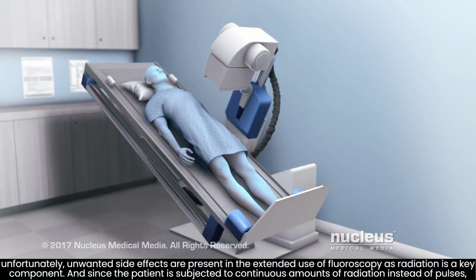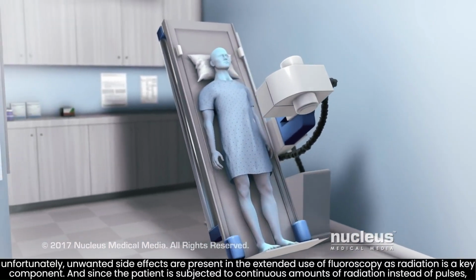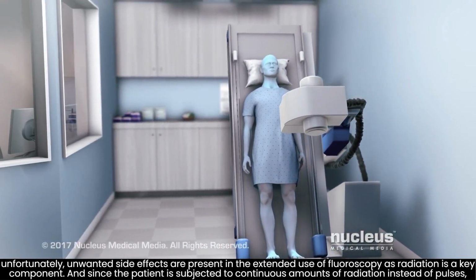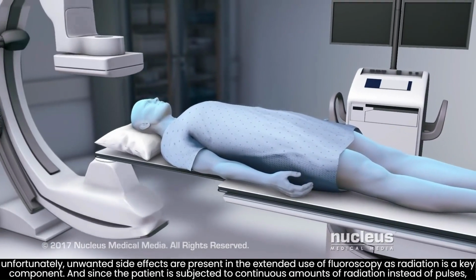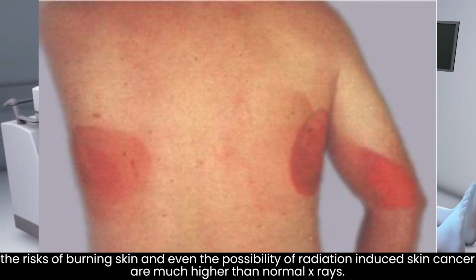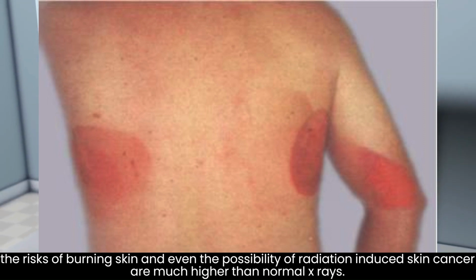Unfortunately, unwanted side effects are present in the extended use of fluoroscopy, as radiation is a key component, and since the patient is subjected to continuous amounts of radiation instead of pulses, the risk of burning skin and even the possibility of radiation-induced skin cancer are much higher than with normal X-rays.